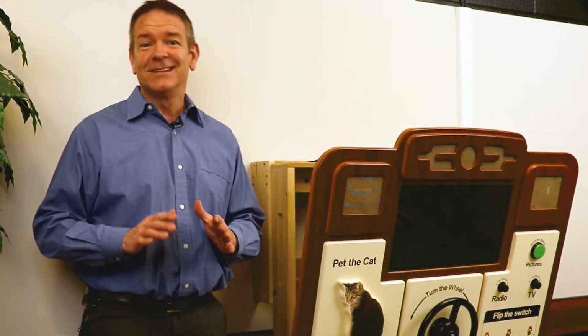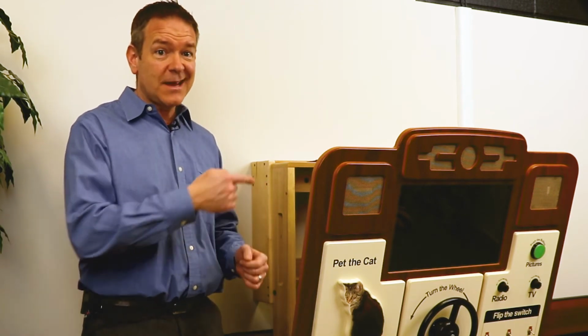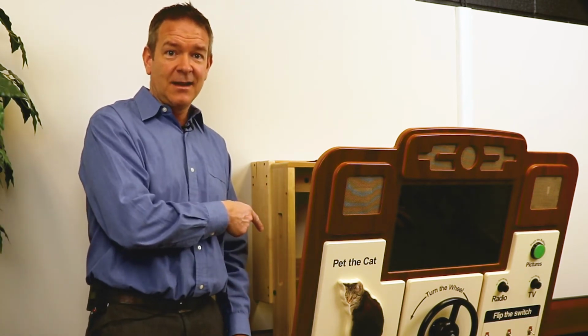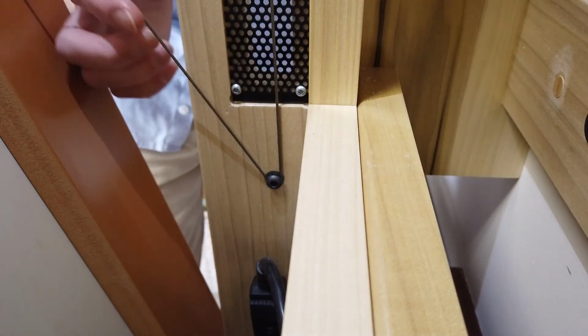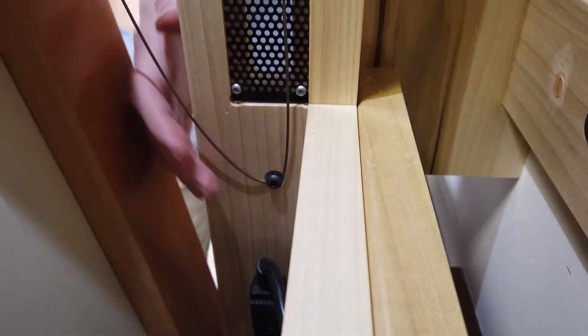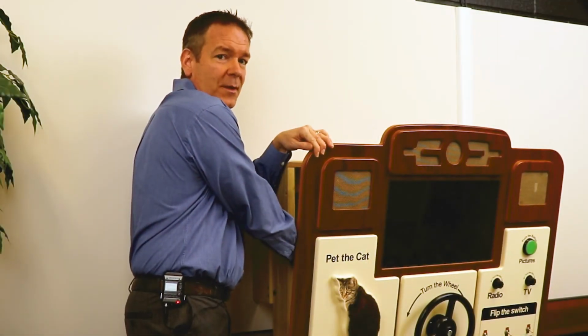This next part is a little tricky depending on what side you're detaching first. In this case, I'll start with the left-hand side. I'm going to use my right hand and follow the cable down to the screw button and detach it. You may need to close the front panel on your arm just to loosen the cord a bit to help with this step.